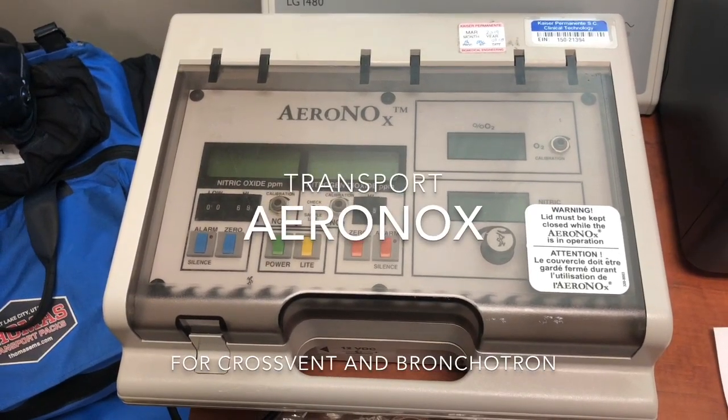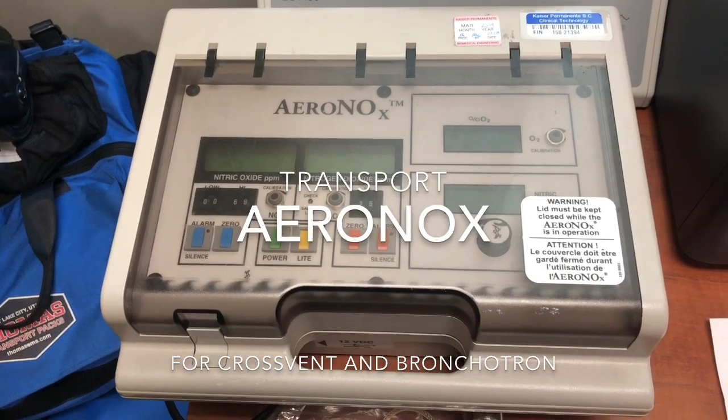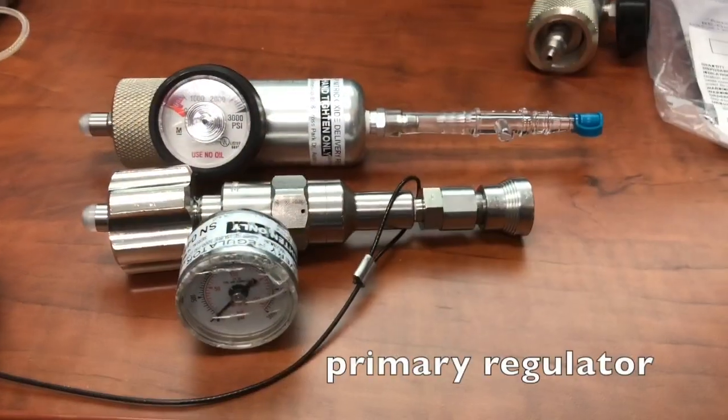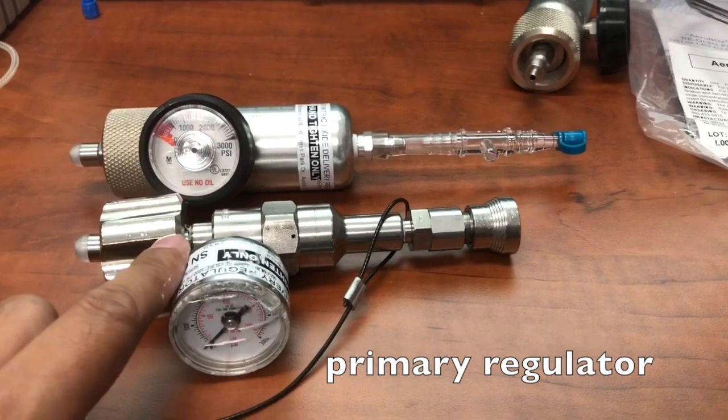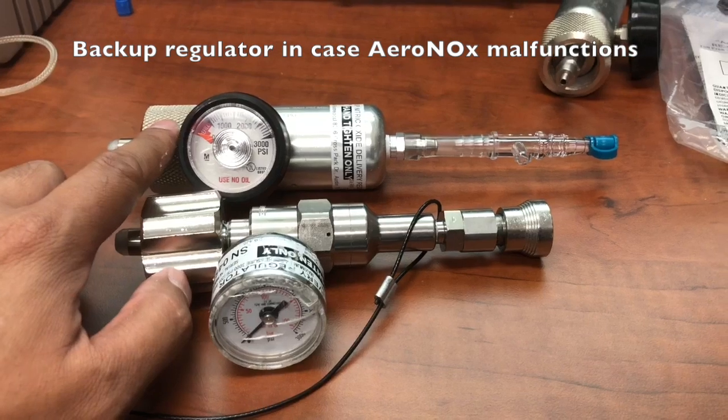We're going to show you guys how to set up the Aranox with conventional and high-frequency. There are two regulators you'll need. This one right here will already be hooked up to your iNO tank, and this is your backup regulator.